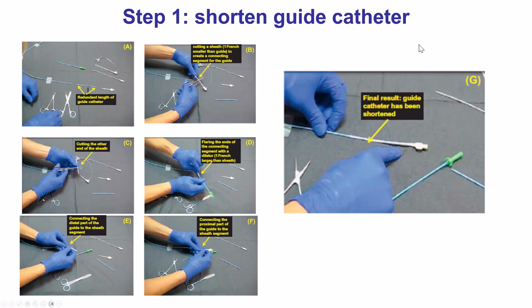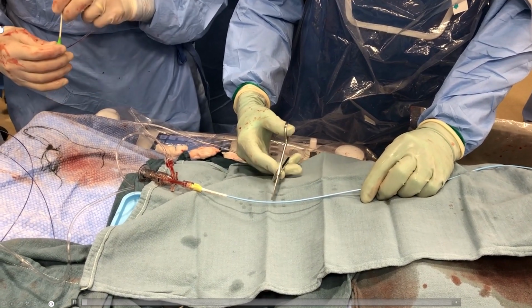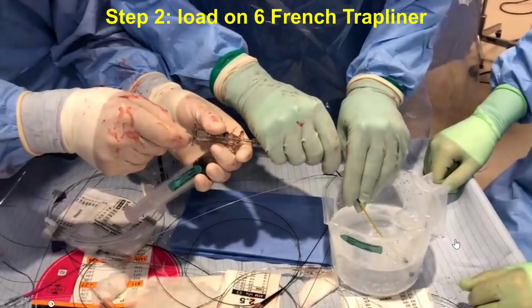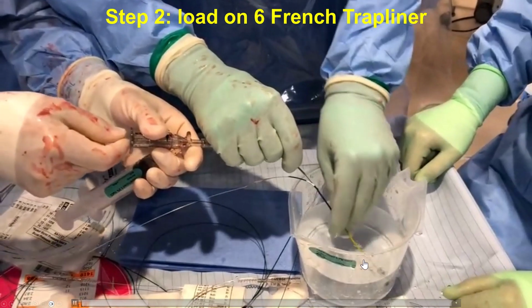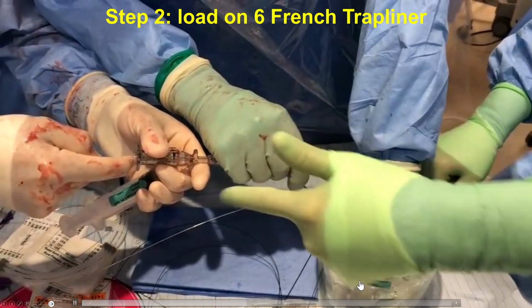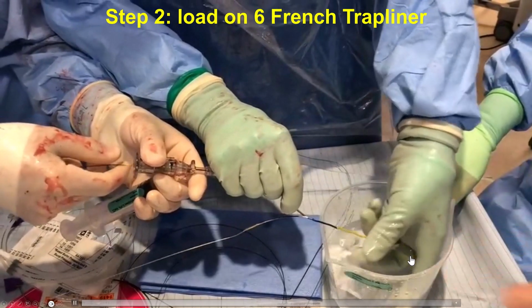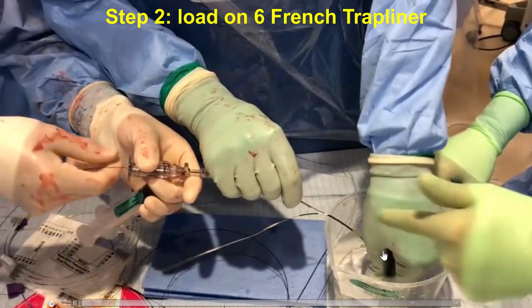How to shorten a guide catheter is shown in a separate video, but essentially we cut it and we use a connecting sheath, 1 French smaller than the size of the guide catheter. Then we actually load the Amplatzer vascular plug on the guide extension. This is a 6 French TrapLiner, and essentially we dip it into water to minimize air aspiration, and then we pull the Amplatzer vascular plug underwater until it enters inside the guide extension.